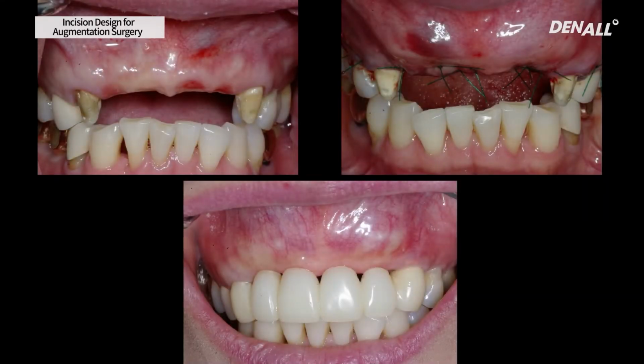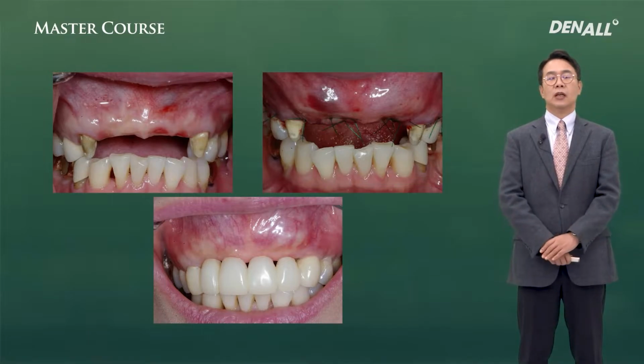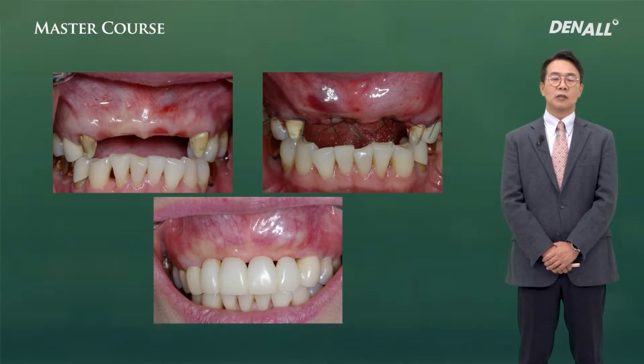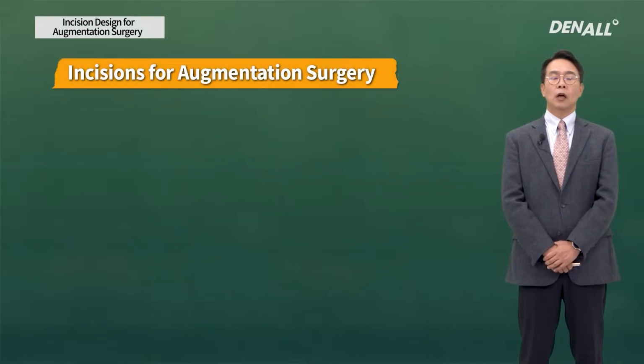If you look at the volume increase, it is quite large, and it's not resorbed that much. If you look at the form of the temporary prosthesis, the site is increased quite a lot horizontally. So a stable and successful augmentation surgery like GBR is done. The suture should not be broken, so making an incision makes the difference in that regard.